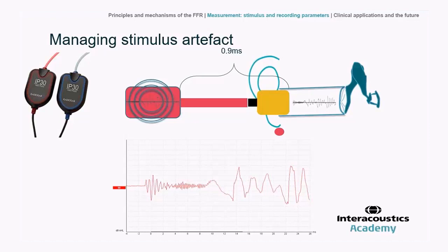response accordingly. And then we also mentioned the possibility of the no sound trial, which can again help easily distinguish a stimulus artifact from a true response. This would be, for example, from clamping the tube, preventing the acoustical stimulus from stimulating the ear, but not changing in any way the electrical artifact. So by seeing any response still arising at that point, that would obviously implicate an artifact and not a true response.